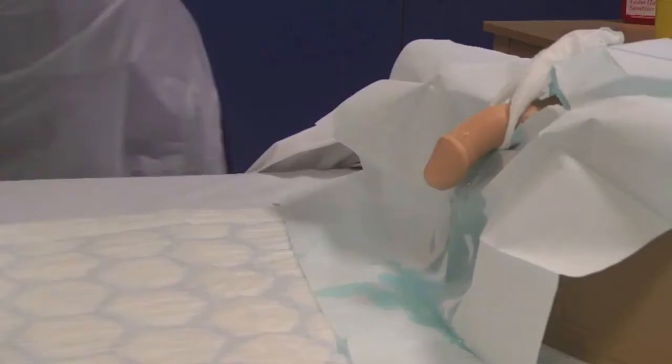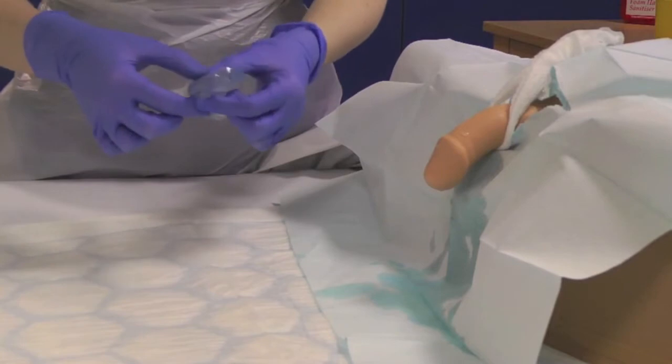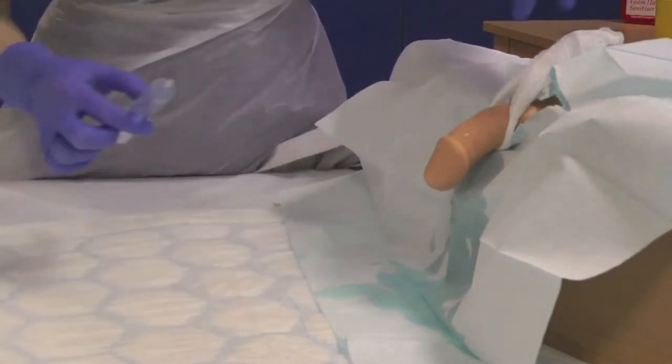Once you have finished cleaning the genitalia, take your instillagel and whilst holding the penis erect, insert 11 milliliters into the urethra.